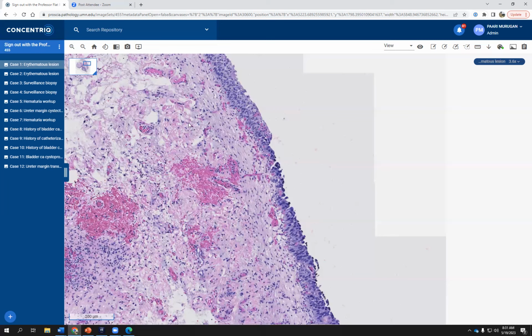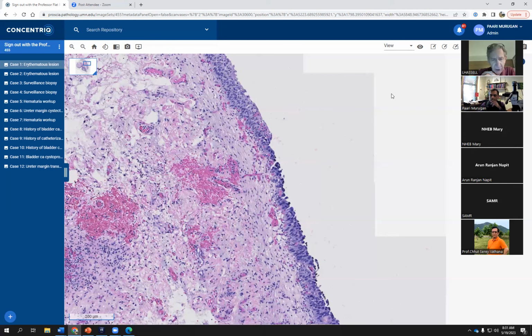Yeah, very good. So one other question about p53 staining. In some of the other organs where I spend more of my time, we recognize several different patterns of mutational related staining, and particularly the null type, which may have been one of the stains that you showed there with the negative staining.